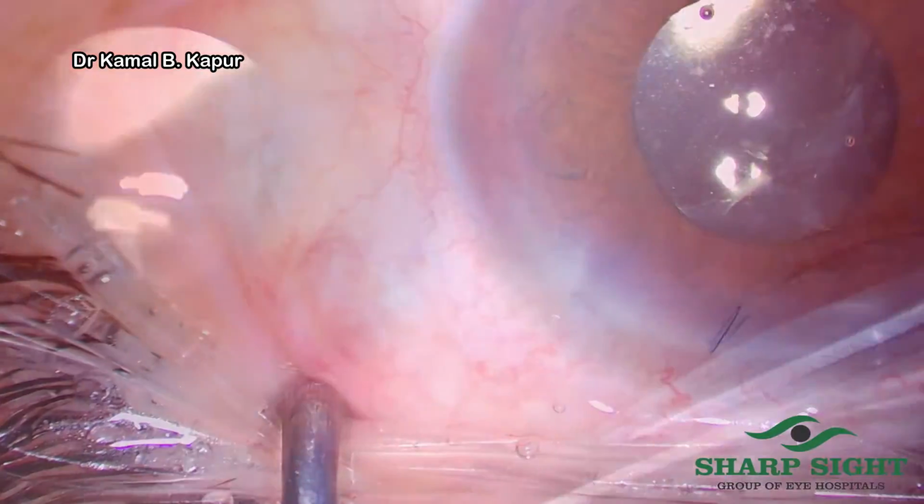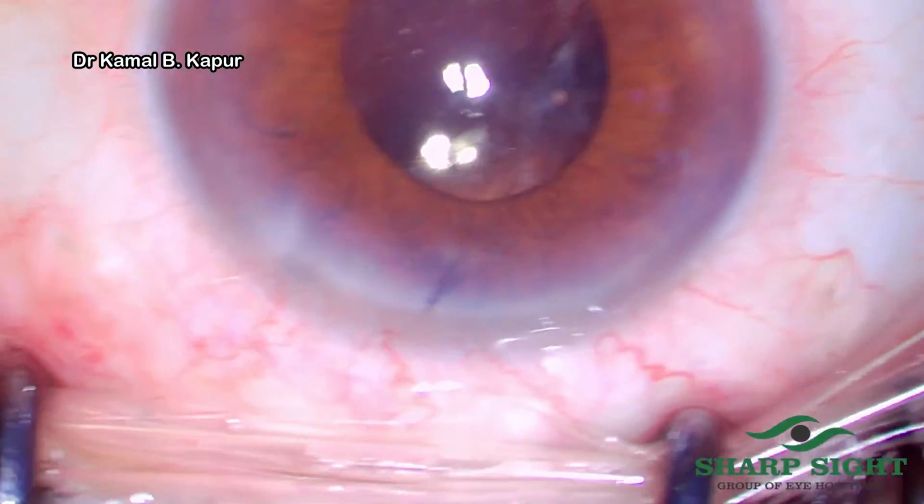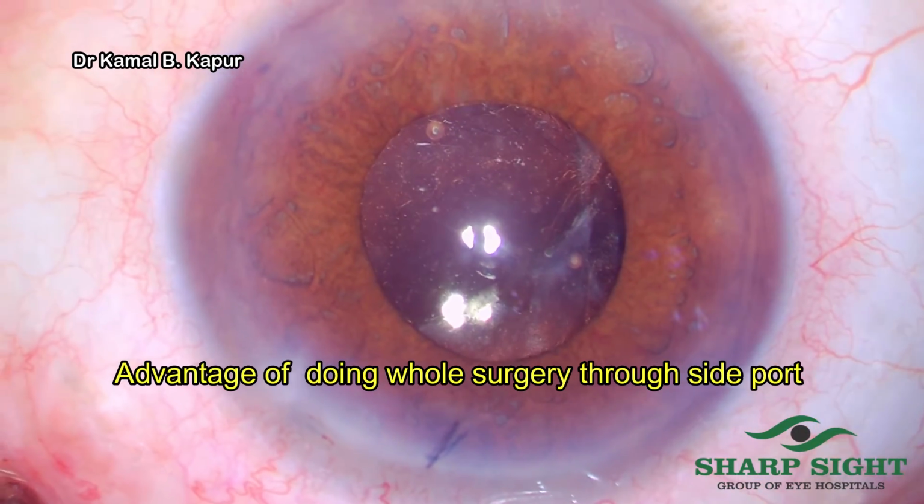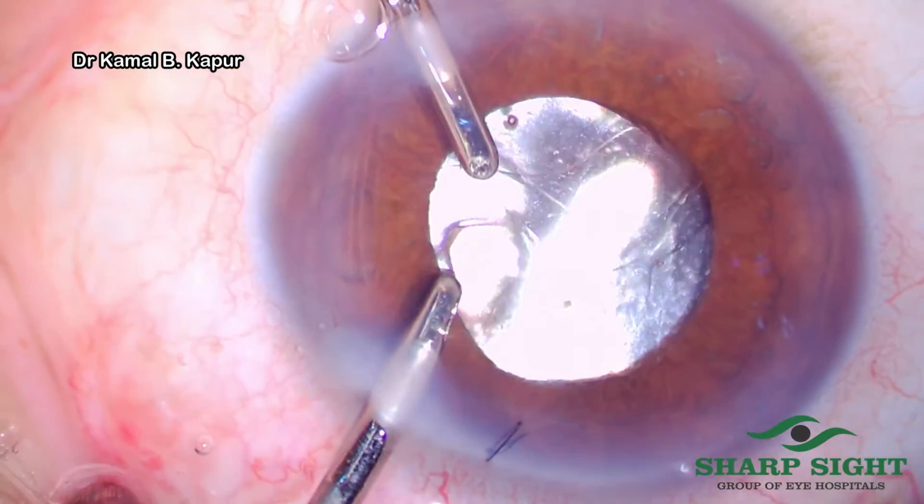But this particular procedure which we have adopted has saved us all the trouble and gave us a happy patient. Secondly, using two side ports only for the surgery has its own advantage. If you notice, the whole surgery has been actually bloodless. There has been no chamber shallowing.